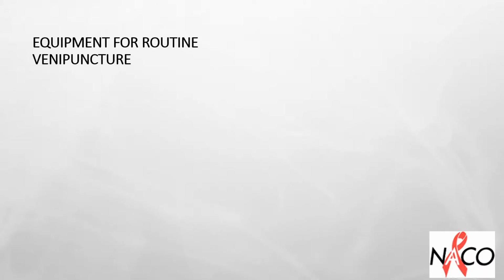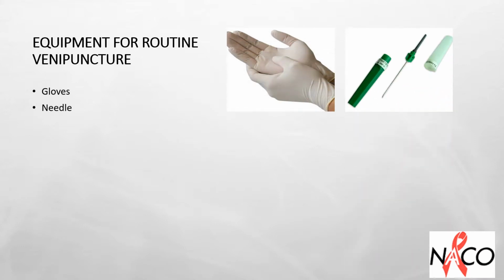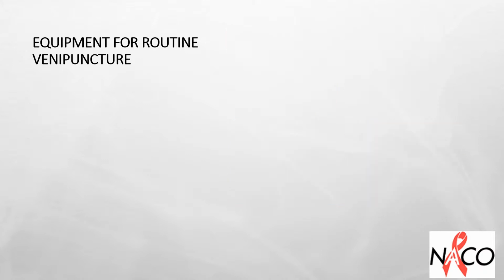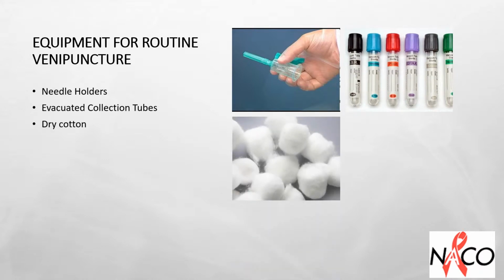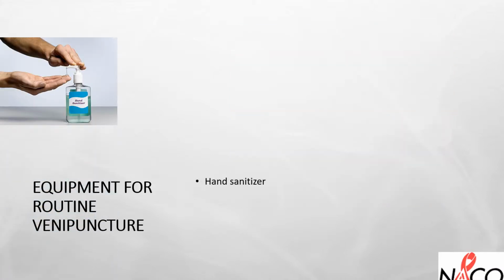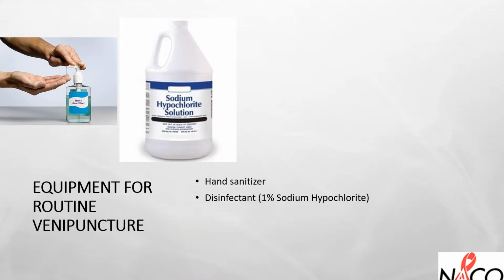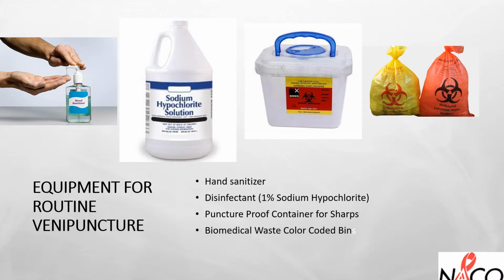Equipment needed for a routine venipuncture are gloves, needle, tourniquet, alcohol wipes, needle holders, evacuated collection tubes, dry cotton, adhesive bandages or tape, hand sanitizer or alcohol based hand rubs, 1% sodium hypochlorite as disinfectant, puncture proof container for sharps, and finally, biomedical waste color coded bins.